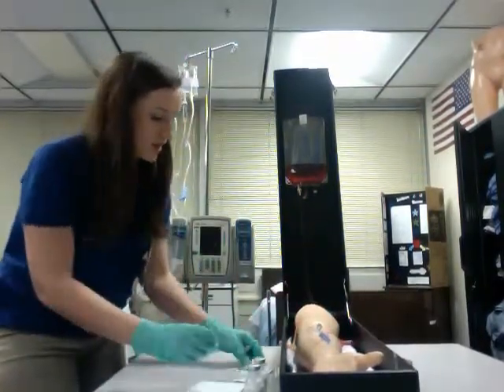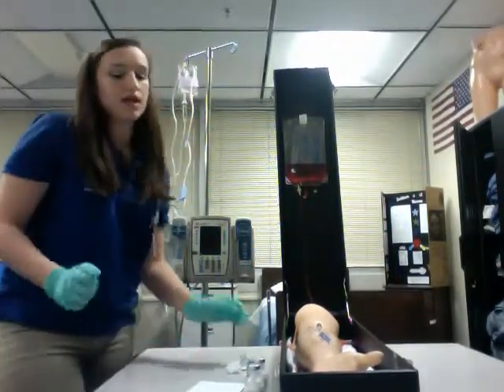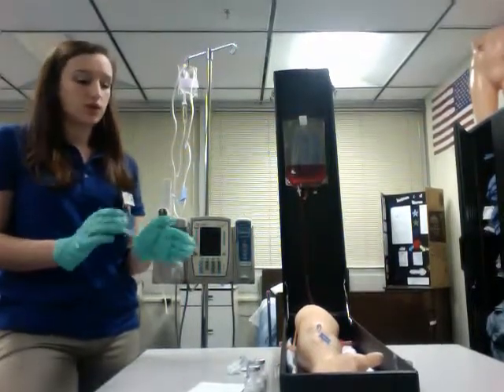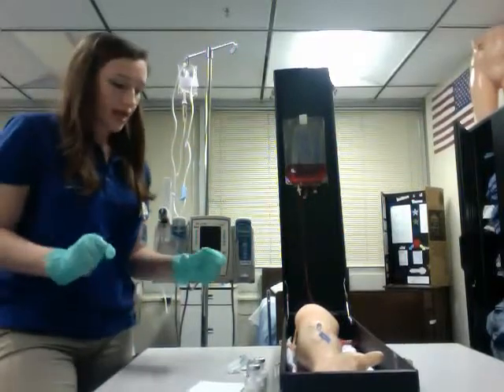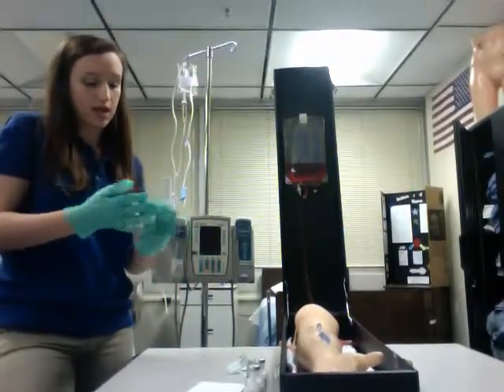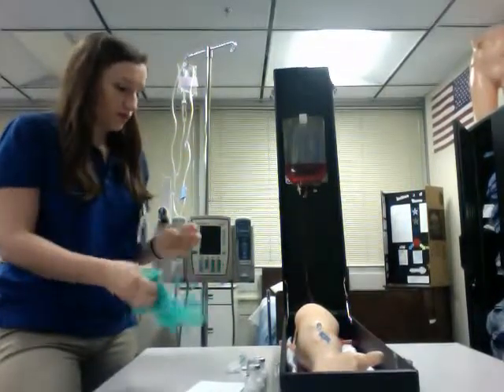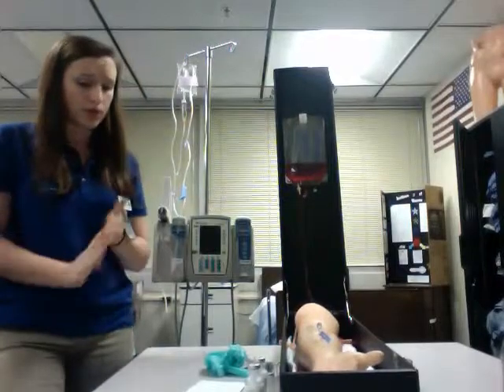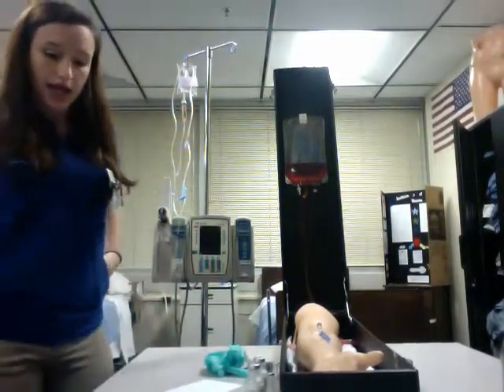Okay. And so the last part of the ASASH method is to administer heparin, which we would only do if the doctor had ordered it for a PICC line or a central line. And so now I'm going to go ahead and remove my gloves. Check again for phlebitis or anything like that. I'm going to wash my hands, and then we're going to go ahead and document.